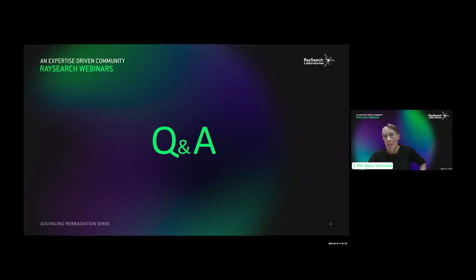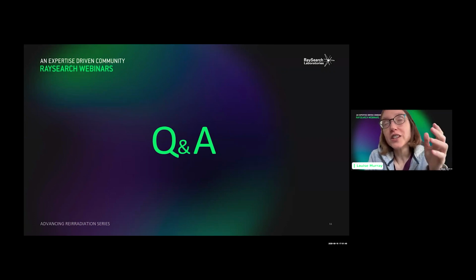Louise, do you have anything to add? Yeah, it's a great question, and it's a really common question. I think nobody knows what the right answer is. The Michigan reference, which I just put in the chat in response to somebody's question, is what they do in Michigan, and they've treated a lot of patients with it, and they seem to be getting on okay. In terms of hypofractionation and high doses per fraction, again, there are uncertainties as to how well the LQ model holds.